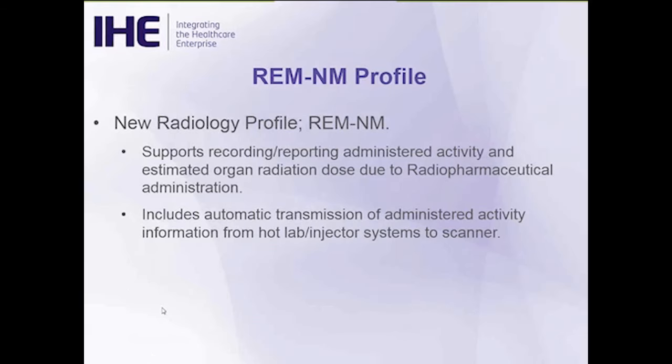So as we said, this is a new profile, REM-NM, built upon the REM profile. The purpose of it is to support recording and reporting administered activity due to radiopharmaceutical administration. So similar to x-rays, but doing the radiopharmaceutical PET SPECT nuclear medicine procedures.